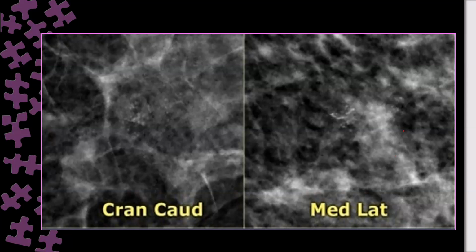This is a distribution. Then I have to tell the morphology of this type of classification. Let us start by craniocaudal. How does it look on craniocaudal? Spindle shape. Spindle?